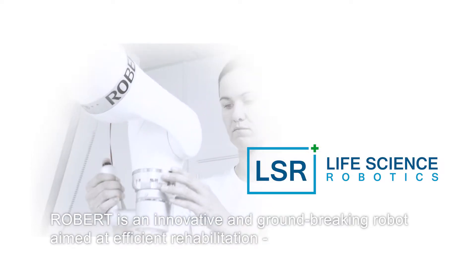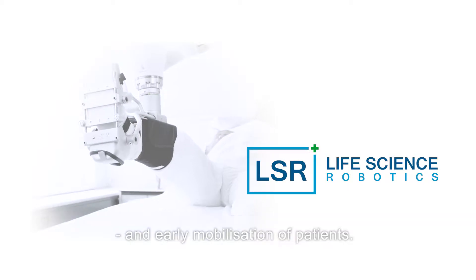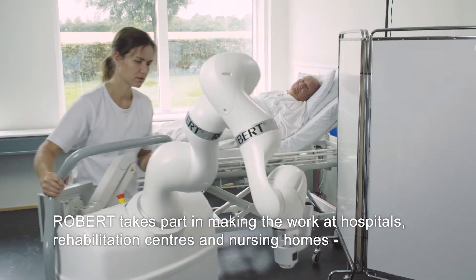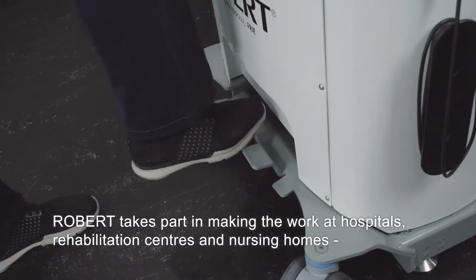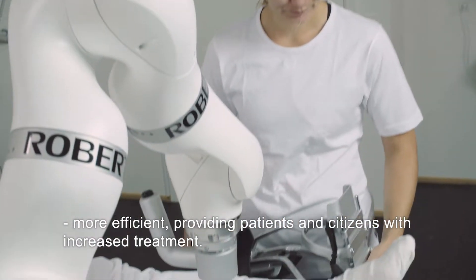Robert is an innovative and groundbreaking robot aimed at efficient rehabilitation and early mobilization of patients. Robert takes part in making the work at hospitals, rehabilitation centers and nursing homes more efficient, providing patients and citizens with increased treatment.